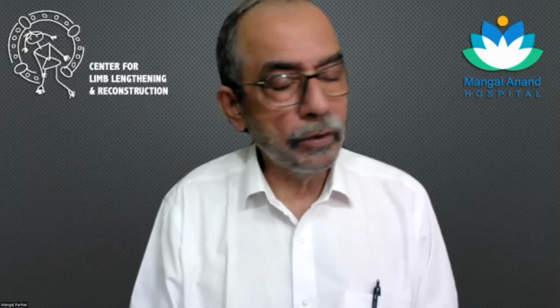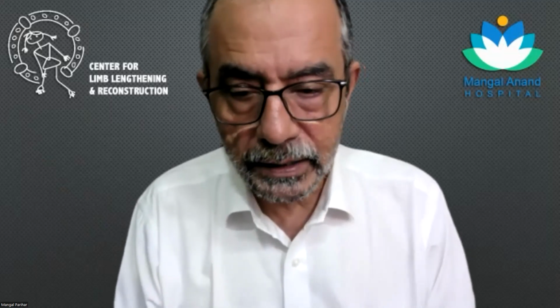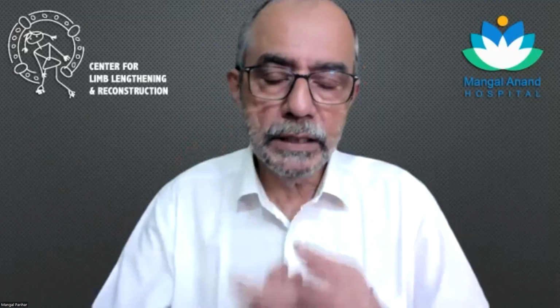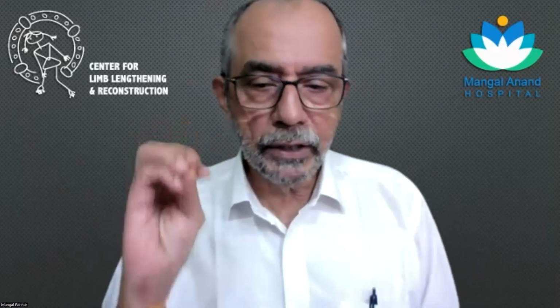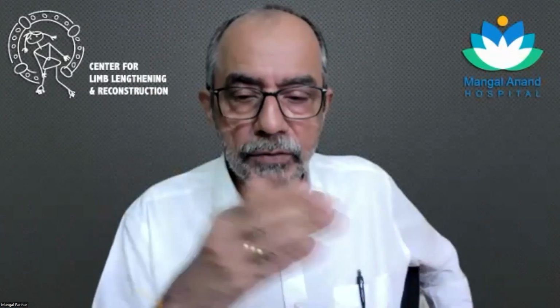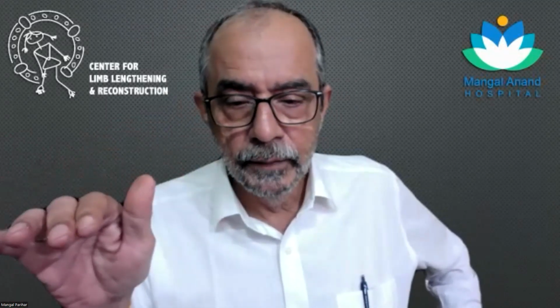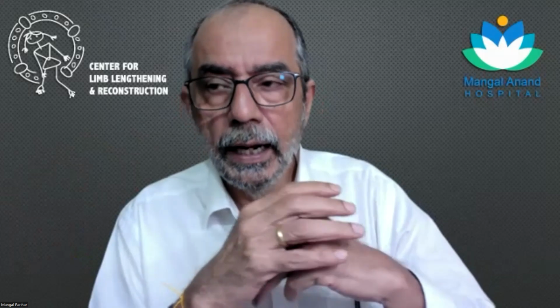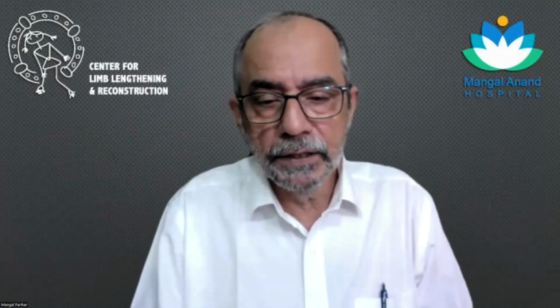So the fixator will tend to get loose over time. The patient is not going to tolerate the fixator for 5 or 6 months. So therefore, I think both of these things should not be mixed up. For acute correction, you should have some form of internal implant, whether you're doing open wedge or closed wedge. The only situation where you can do acute correction with a fixator, I would say with an Ilizarov, is a dome correction, where you've got good stability and you expect it to heal in 3.5 months, by which time the fixator can be removed.